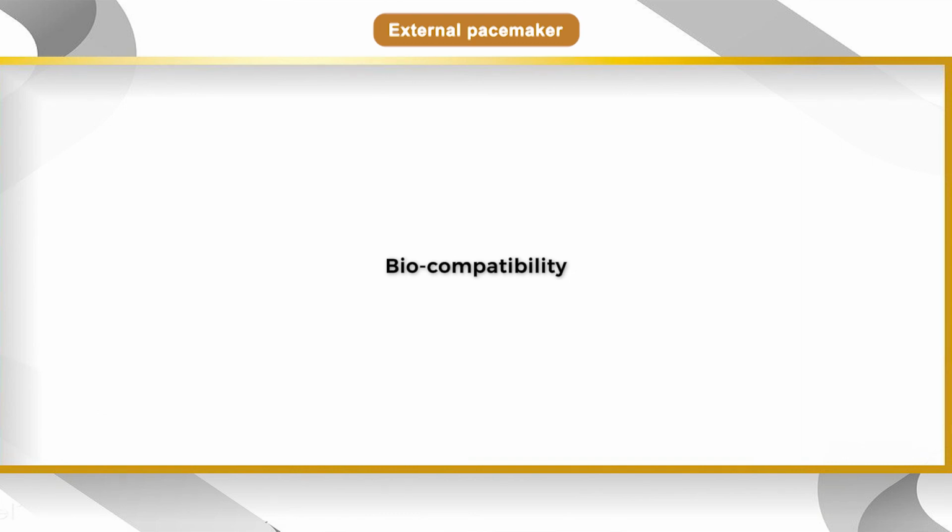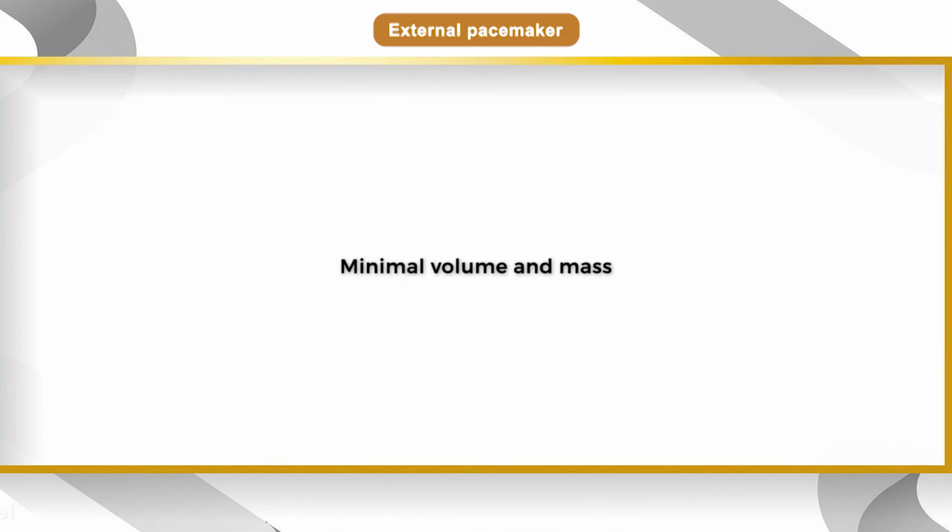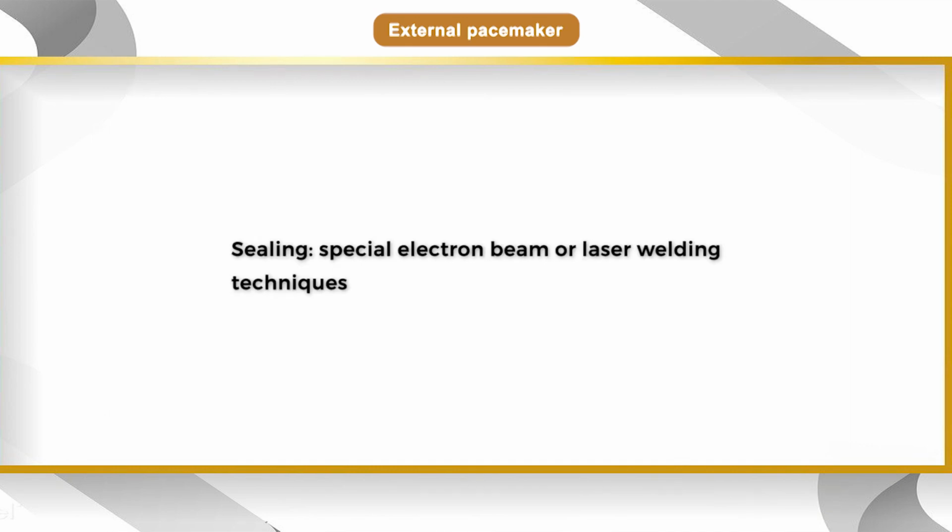The packaging needs biocompatibility and protection of the internal circuit from a corrosive environment. Minimum volume and mass are required. It is made from titanium or stainless steel, and it is specially sealed by electron beam or laser welding technique for protection of the pacemaker as well as the human body.